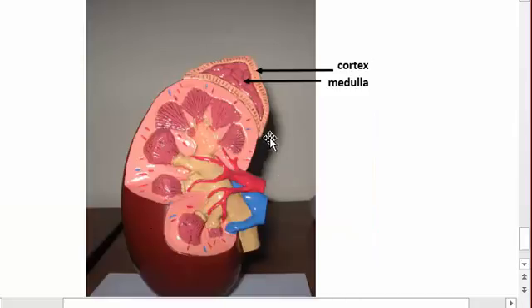And then this here is the suprarenal or adrenal gland, as you can see, and the outer area is the cortex with those three zones, and the inner area is the medulla. The hormones produced by each of the cortical zones and the hormones produced by the medulla are different, and you need to know the functions of these hormones.